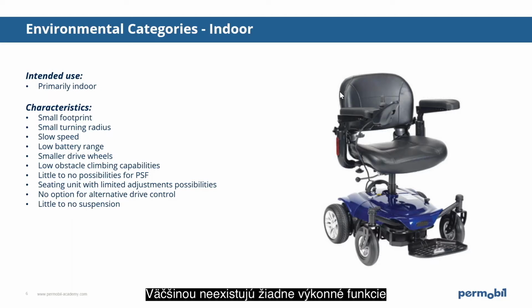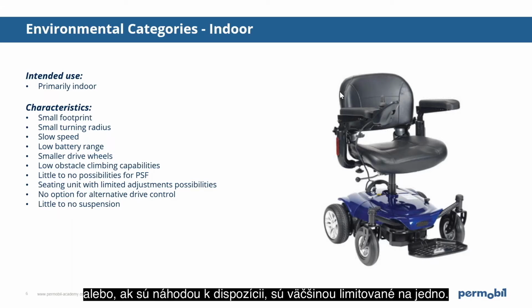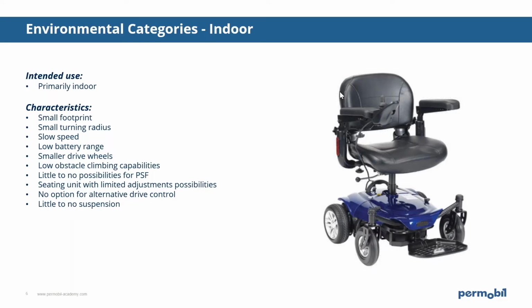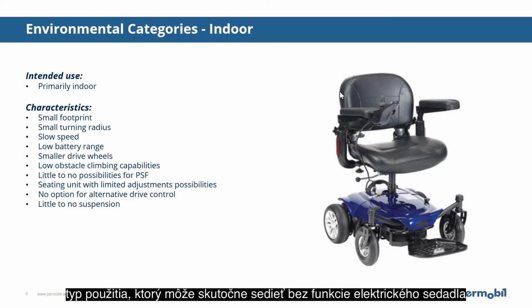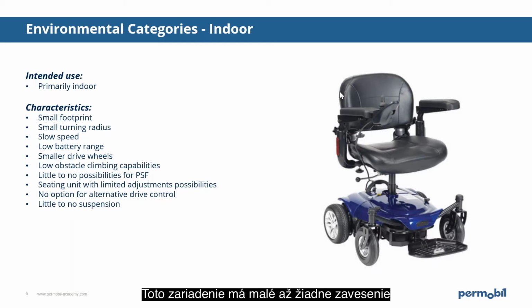There are mostly no power seat functions available, or when they are available, it's mostly limited to one. And the seating unit mostly has no or limited adjustment possibilities. This type of device doesn't really allow for alternative drive controls, but if you have a type of user that can sit without power seat functions, you can also estimate that they won't need an alternative drive control. And this device has little to no suspension.